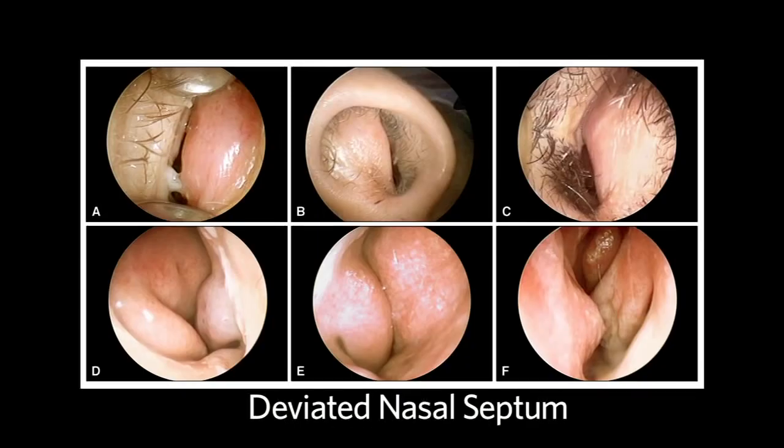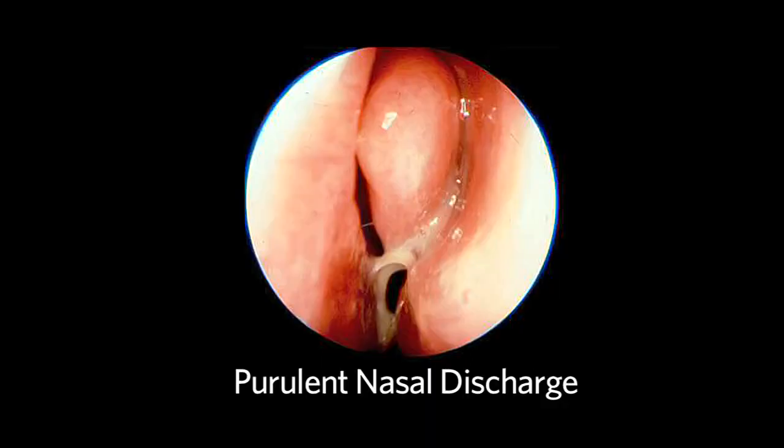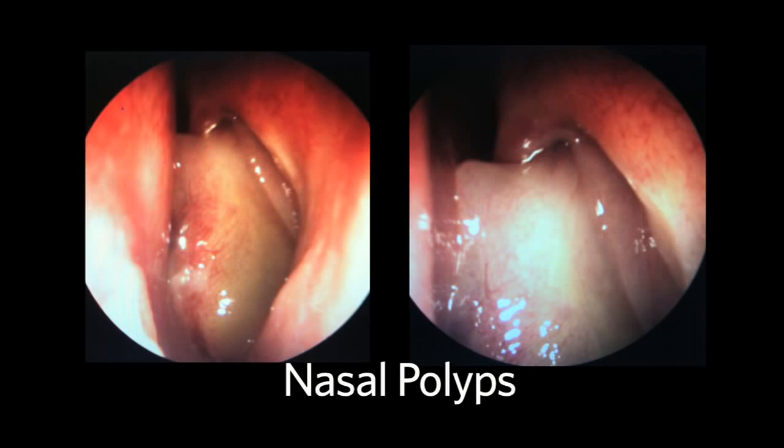In doing the endoscopy, it gives us the opportunity to identify internal nasal pathology, such as a deviated nasal septum, purulent nasal discharge, or nasal polyps.